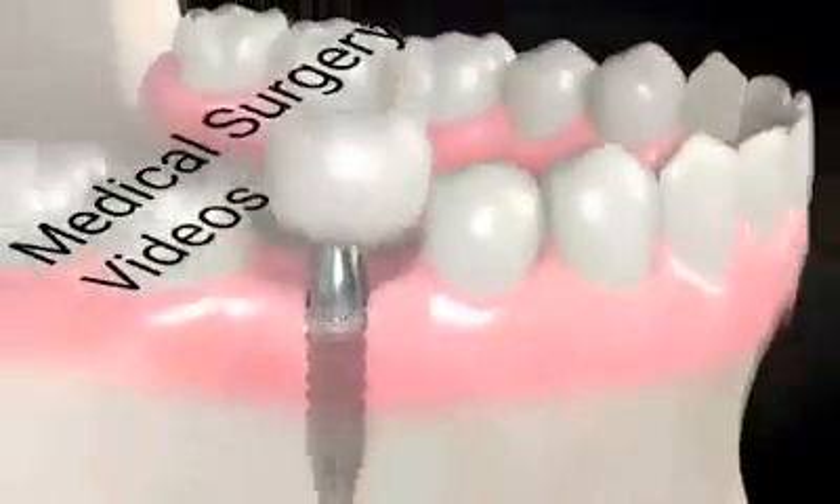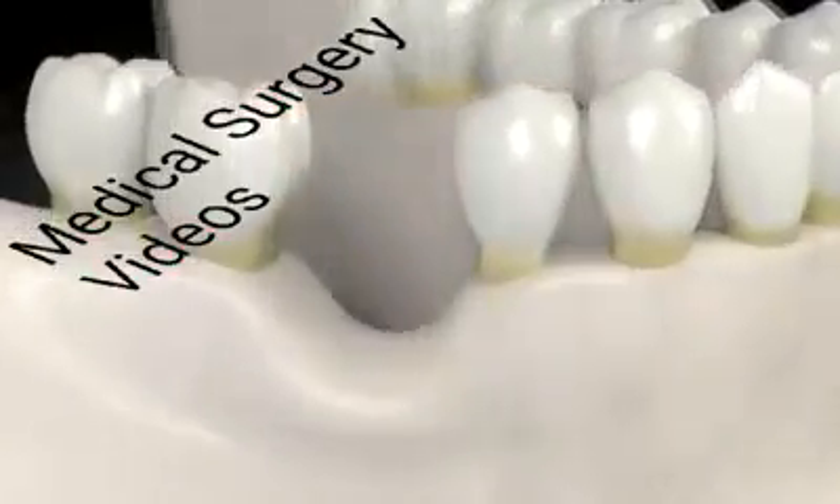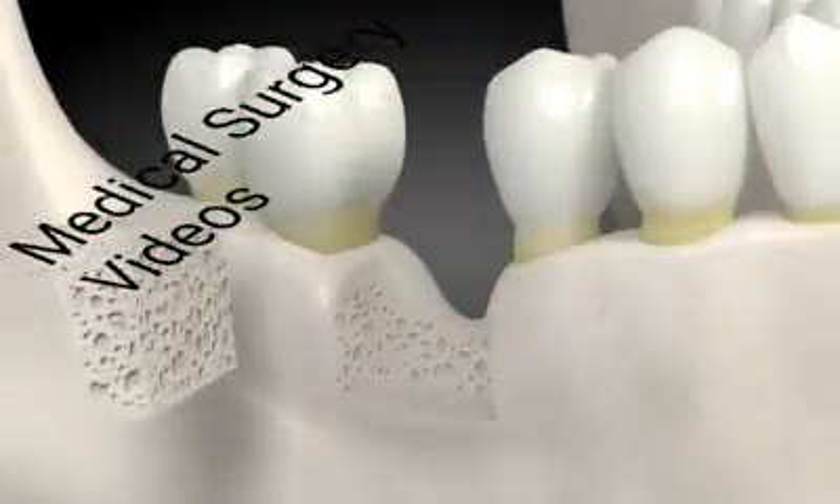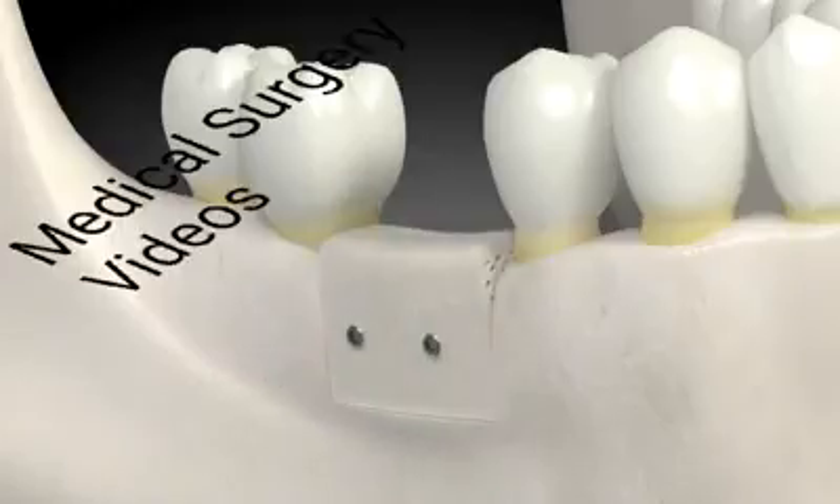A tooth is placed on the dental implant. For patients that have more bone missing, a technique involving placing blocks of bone in the area with missing bone works well. The blocks are shaped to the desired size and placed with titanium screws, and are left to heal for four to five months.